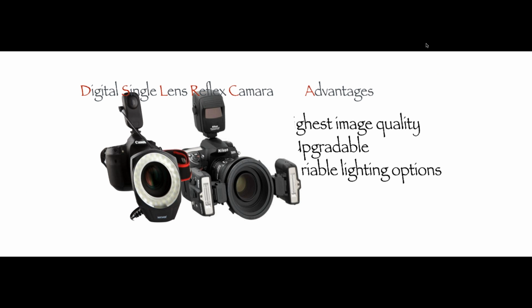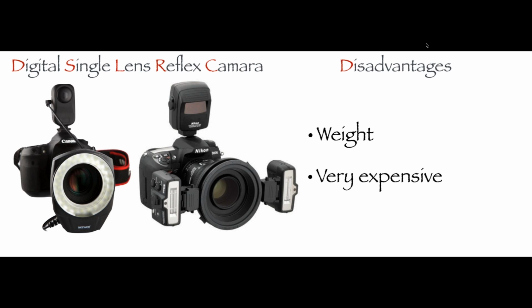And they have variable lighting. You can have either the ring flash or the point flash. Dr. Hallock and I at the school have our own little photo studio, and we have umbrella flashes. I mean, we have a whole bunch of equipment, but you can use anything you want with these cameras and all these accessories. Obviously, they have a cost, but they will really help you, and it will enhance the quality of the photos that you're going to obtain.